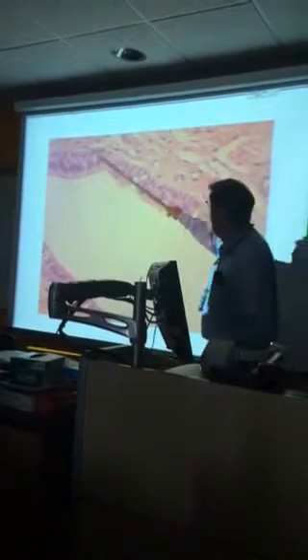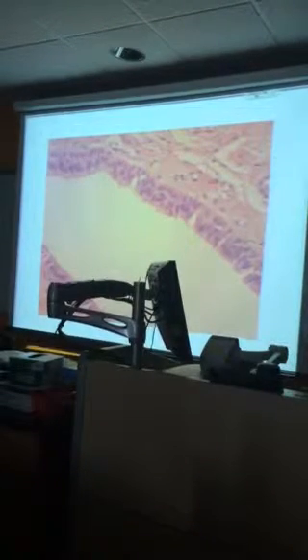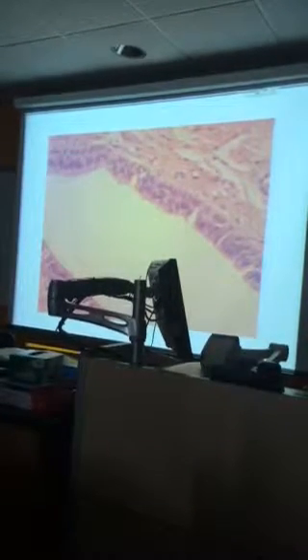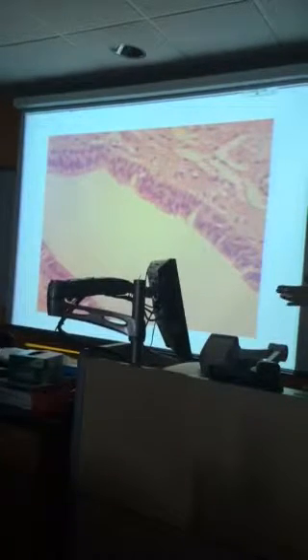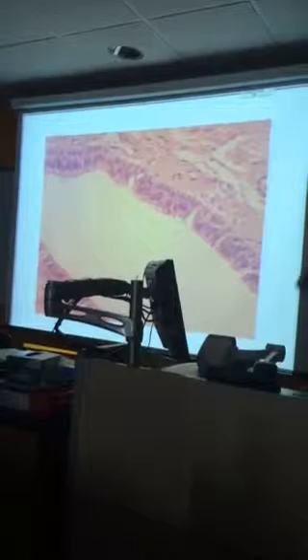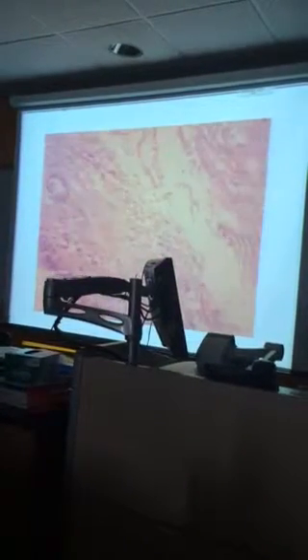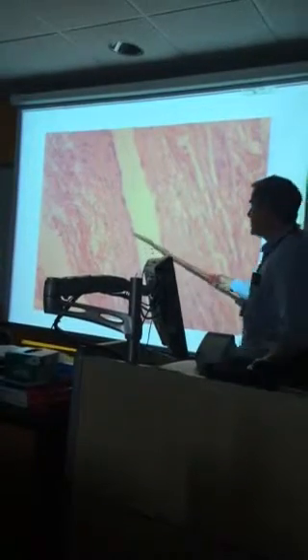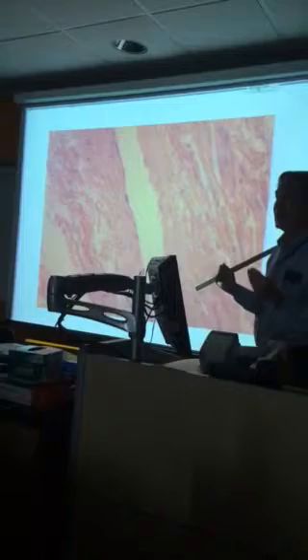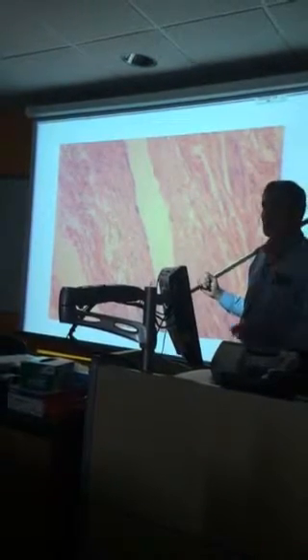You can see layers of nuclei. Again, the nuclei are oval shaped. So stratified columnar epithelium in these larger salivary gland ducts in the submandibular. The small salivary gland ducts are usually a simple cuboidal epithelium with rounded nuclei. And again, blood vessels are going to look like this. Simple squamous. A single layer of simple squamous lines all blood vessels, smallest capillaries to largest veins and arteries.